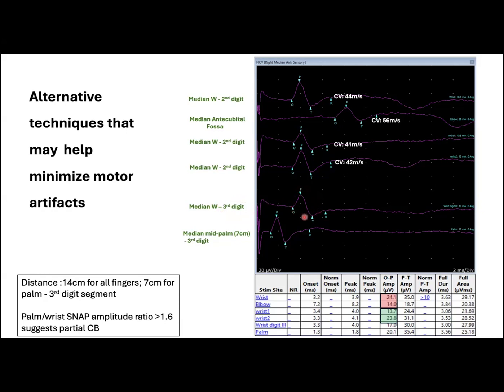This antidromic median sensory palmar study can be helpful not only to show focal changes in conduction velocities, as we can see here in these tracings, but also to indicate a possible conduction block at the wrist when the palm-to-wrist amplitude ratio is above 1.6, which is not the case here.